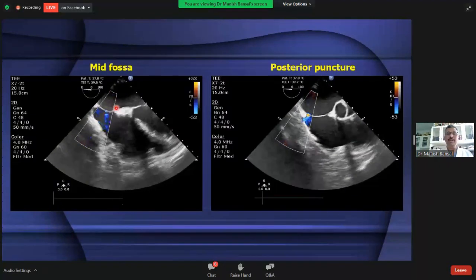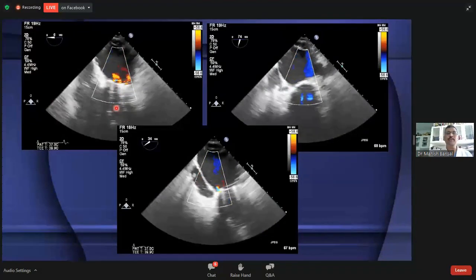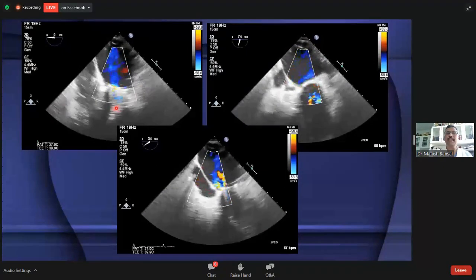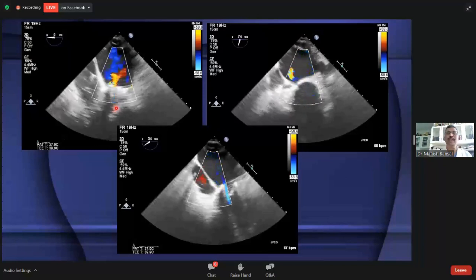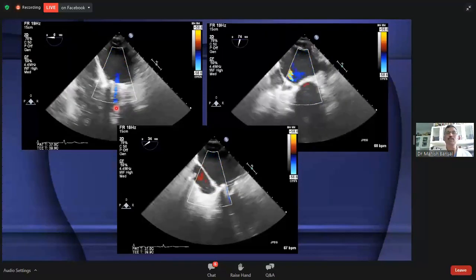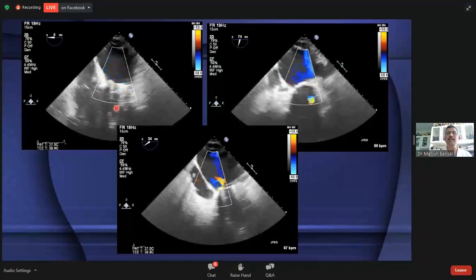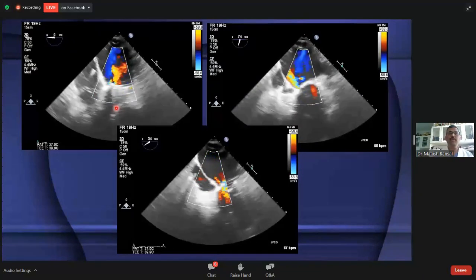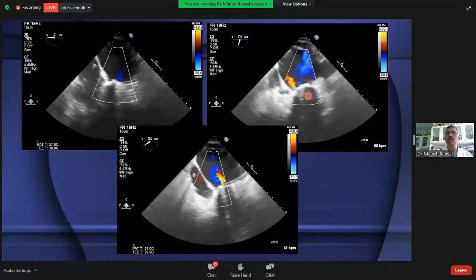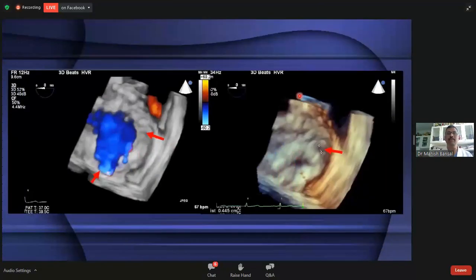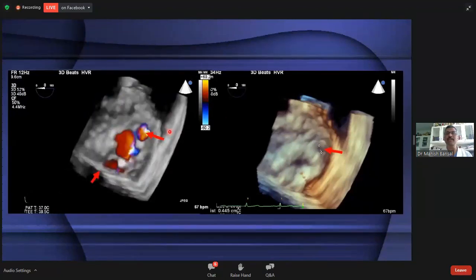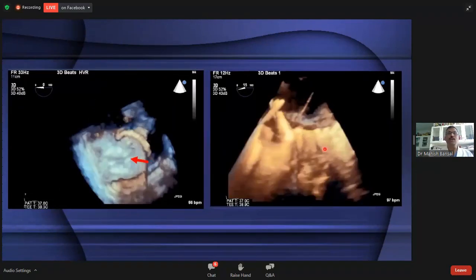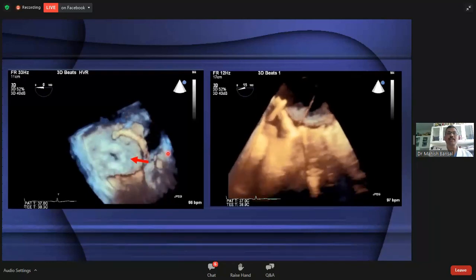Once septal puncture is done, the next step is to cross the defect, which is the most challenging step in paravalvular leak closure and is often very frustrating because it is totally blind. We have to blindly guide the wire through the defect — fluoroscopy can give some idea but it is not easy. Here is an example where 3D was really very helpful. This patient had a defect close to the interatrial septum, clearly visible in the 3D image. This is the defect, this is the mitral valve, and here we have the interatrial septum.